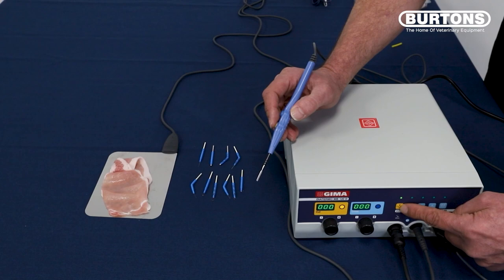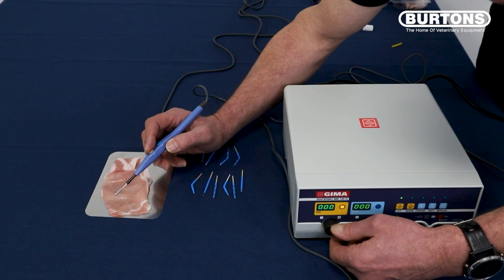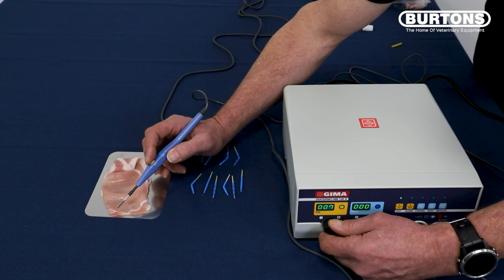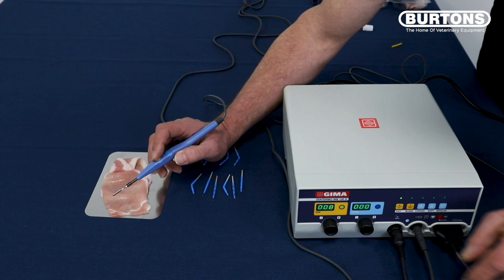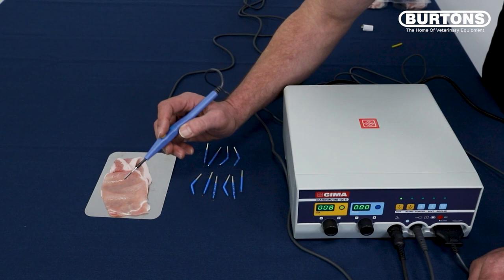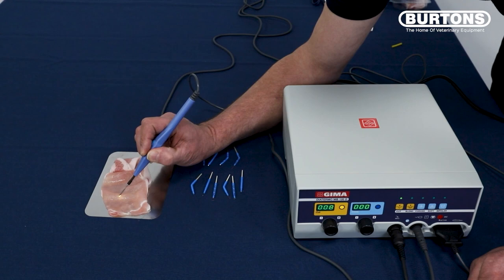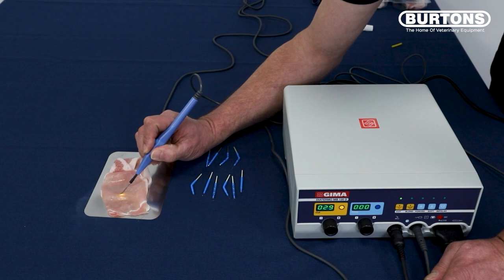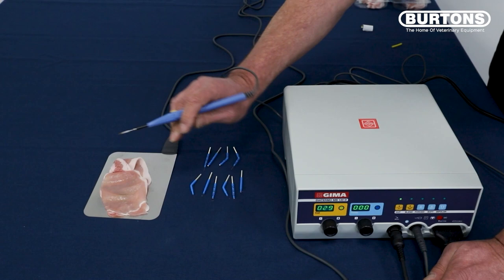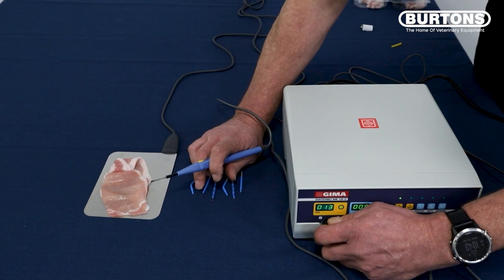So all I'm going to do is turn the power up a little bit and start off quite low. One of the questions we get asked is what power setting do I use for what procedure? There isn't really any guideline for that — the advice is to start low and turn the power up until you get the desired effect. With my foot on the foot pedal and finger on the yellow button, I'm just going to make a cut. If I turn it all the way up, you see there's a lot more power, but you also get more charring. So it's best to keep the power as low as you can get away with, as long as it gives you the desired effect.